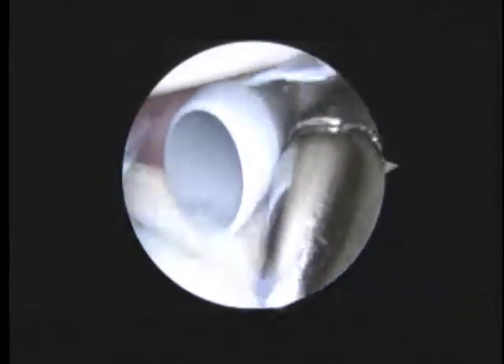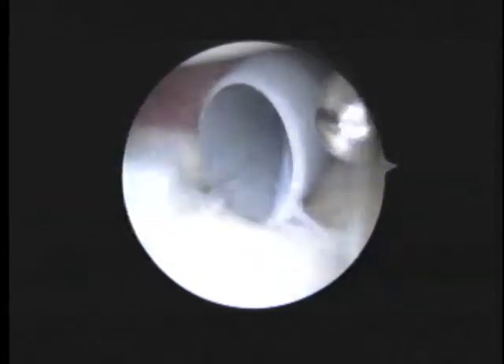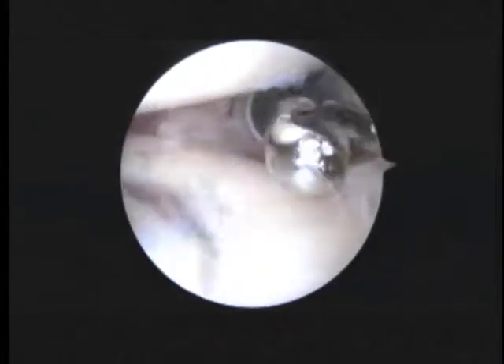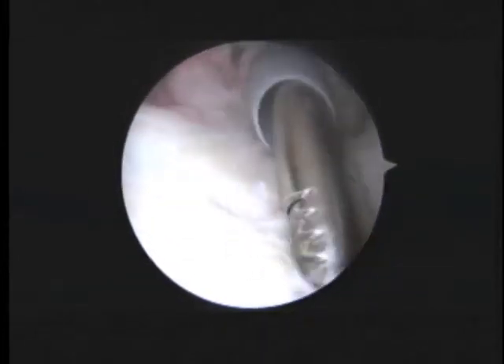Mr. James, Dr. V — I'm here with Missy. We're just getting started on the left shoulder. We're looking in from the back to the front. Everything that you see is magnified 30 or 40 times on the screen. We've got some little areas in the cartilage that we're going to smooth out so we can see what's going on here. And the first thing we look for is usually this biceps tendon. We can see that the biceps tendon anchor is torn and loose right through here, which is what we expected.